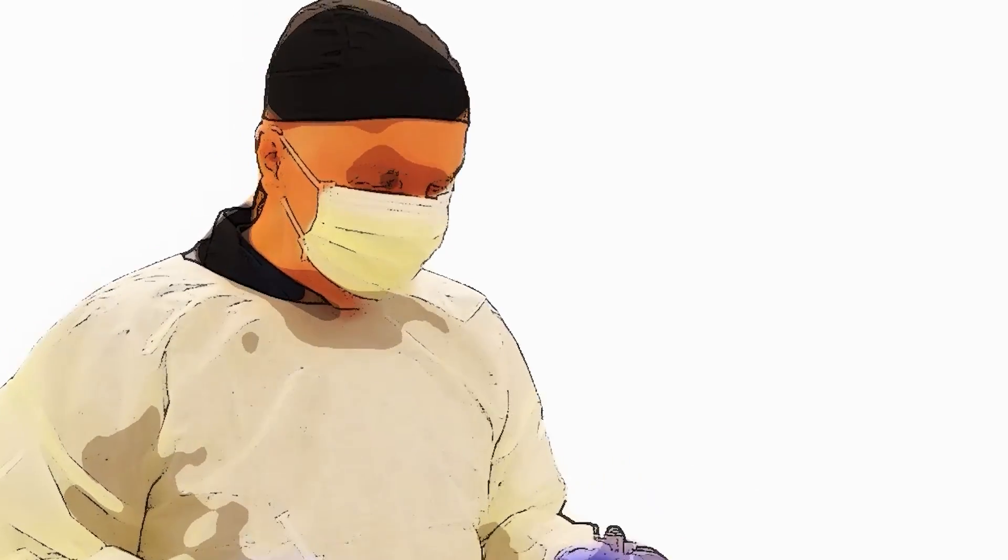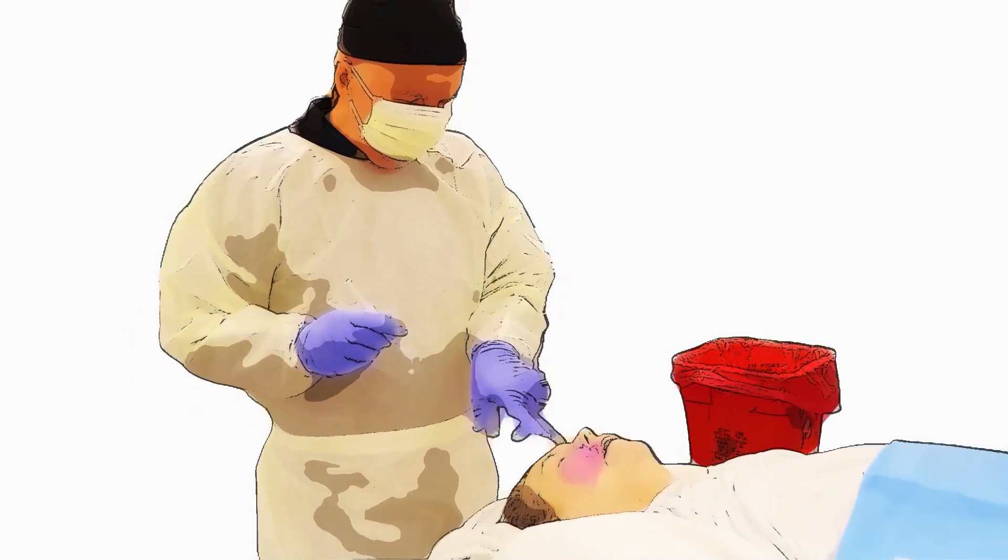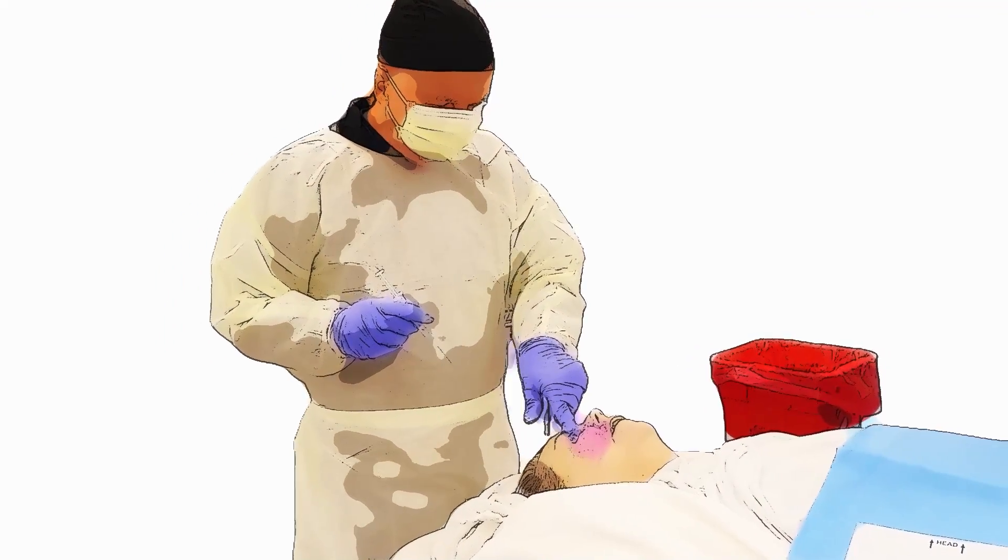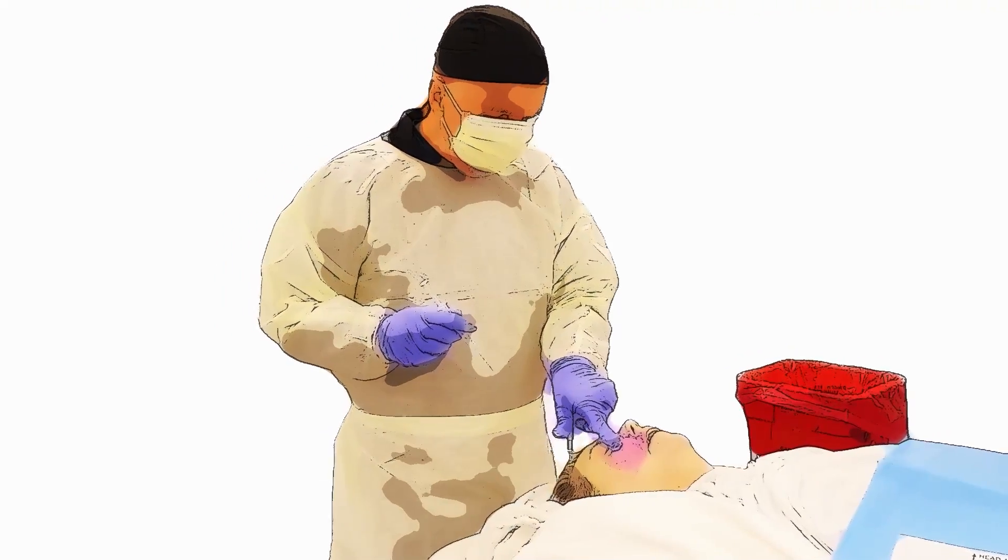I'm going to do the infraorbital nerve block. There's two ways of doing it. You can do it externally - you have the infraorbital ridge here and you can actually feel the foramen right here.